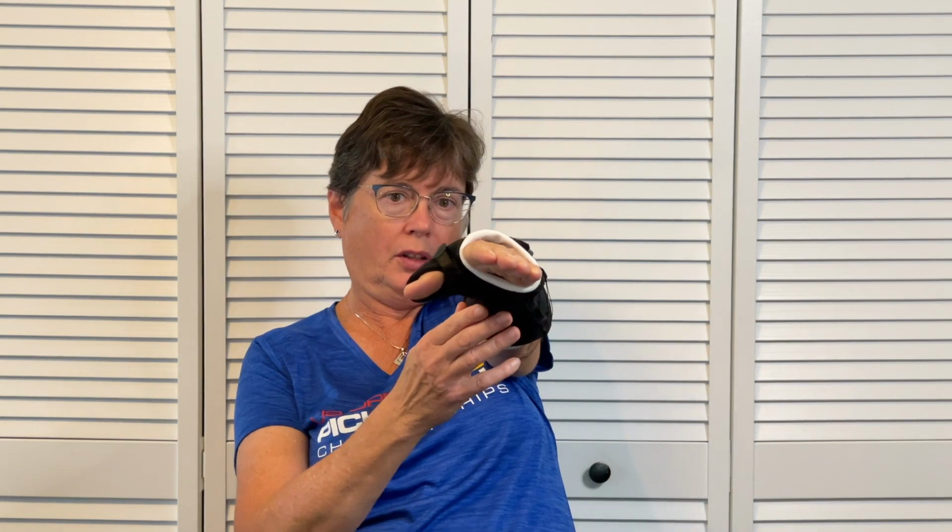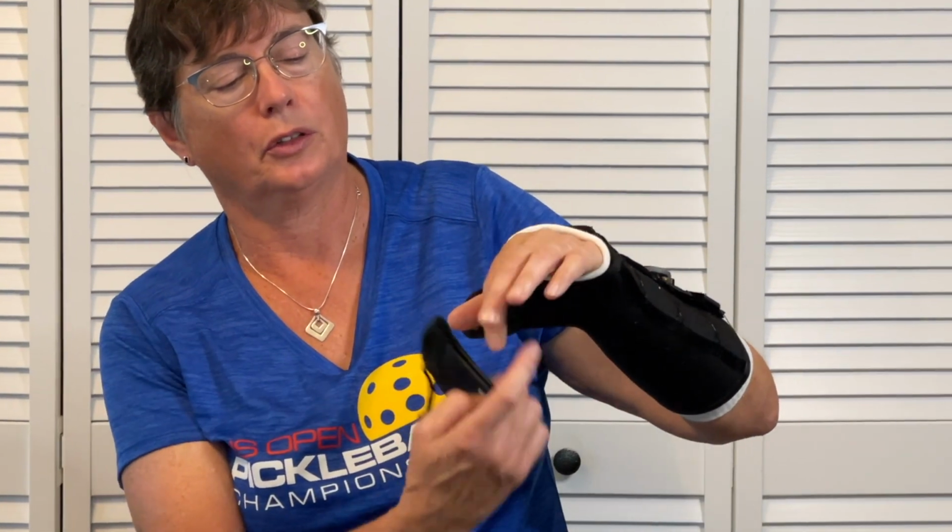The other thing that I wanted to point out is when I first got this, can you see, if you look this way, the thumb sticks kind of straight out. Right now it's at a little bit of an angle, but when your thumb is sticking straight out like that, your fingers never connect to it. So I can't grab anything. If I were to try and grab it, I have to grab it closer to my knuckle. And it's really frustrating.